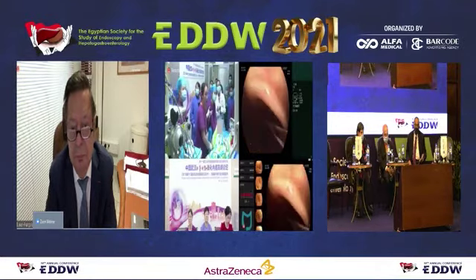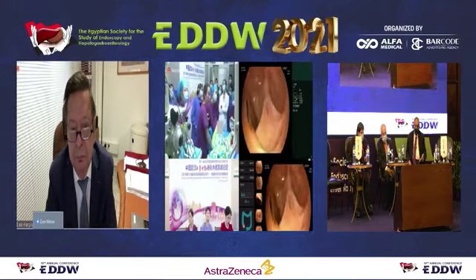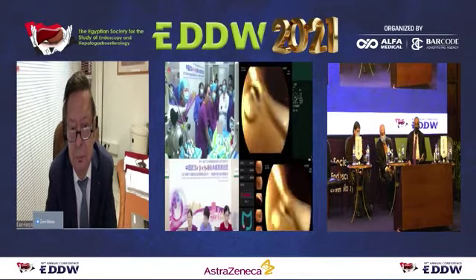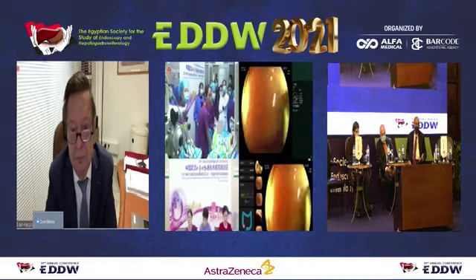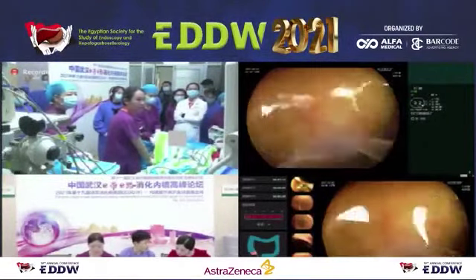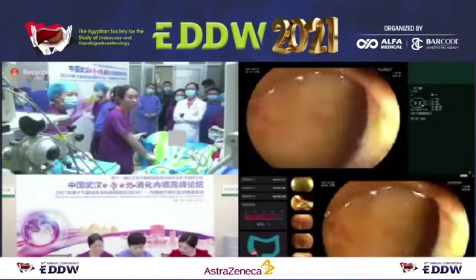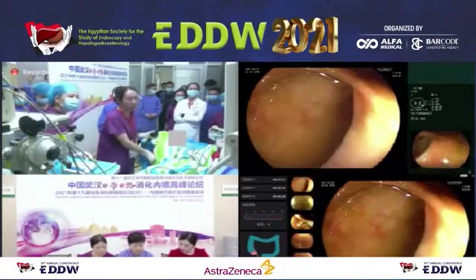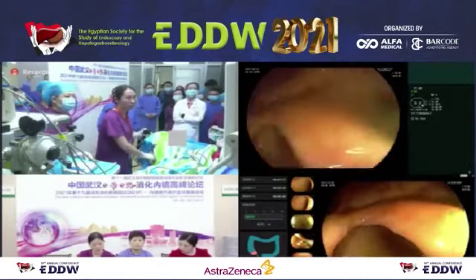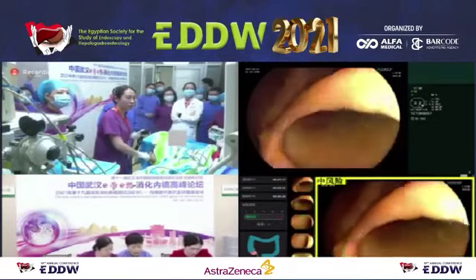For AI detection, we need to stop at this part for several seconds. Then the AI system begins to calculate the pullback time. From this moment, it will start to count how long we spend when we pull the scope back. Now we are entering the ileum. Yeah, it's very nice mucosa. Please take a picture here, and I will draw back.